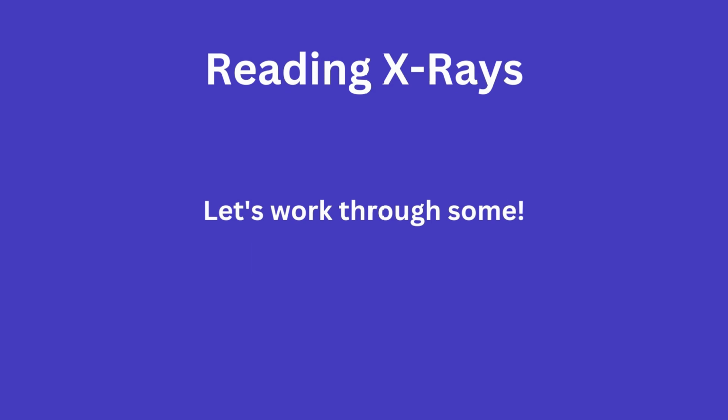Now, disclaimer before we begin, if you are told a different way to approach image reads on rotation, then go ahead and adapt to the program's ways. This is just how I have learned to read x-rays and what I have received positive feedback on thus far.